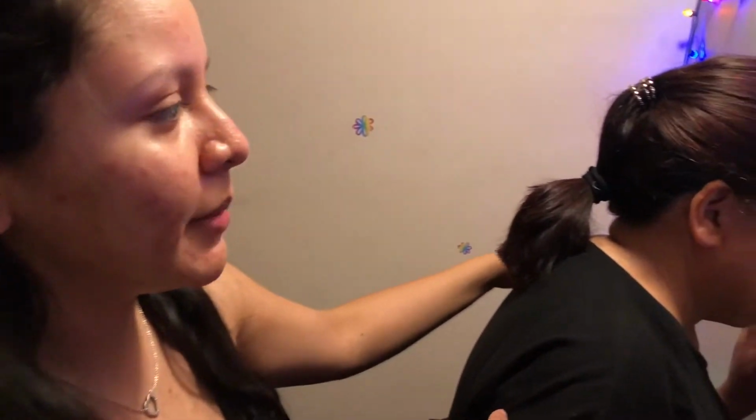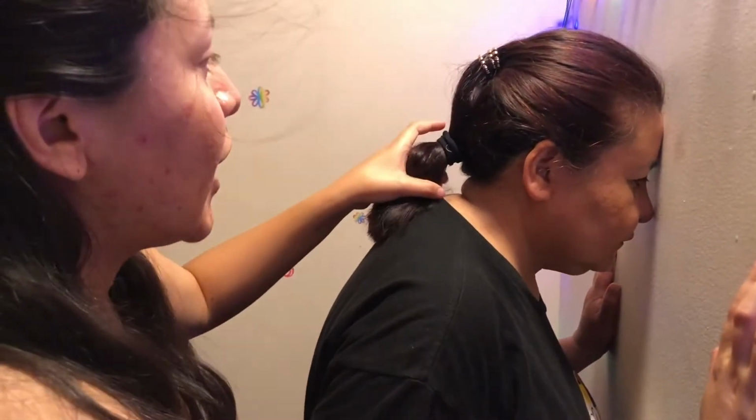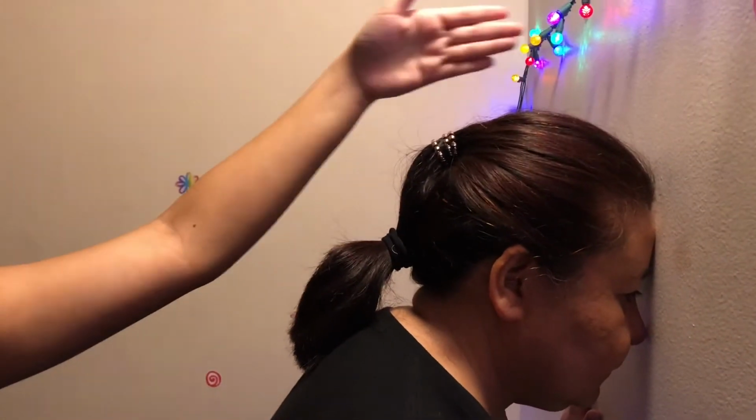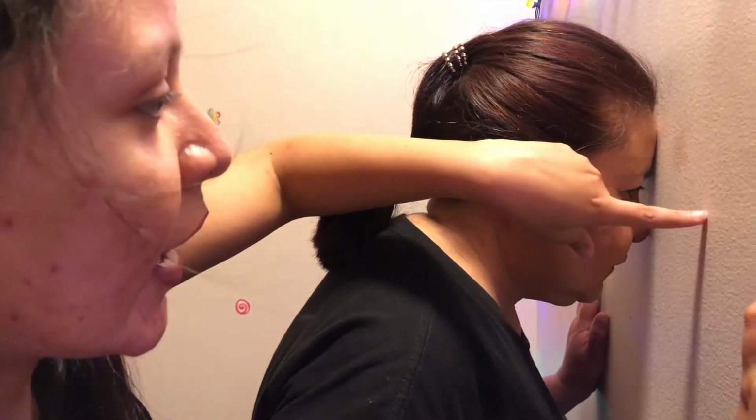So this is the PA axial projection, also known as the Caldwell method of the skull, and we're gonna have our SID at 40 inches. And for this one, we're gonna have the patient position this similar to last time, and we're gonna have the forehead and the nose resting on the wall bucky, and we're gonna have the MSP be centered to the IR, and we're also going to have the OML perpendicular to the IR.